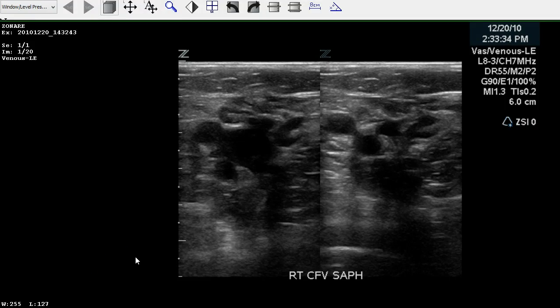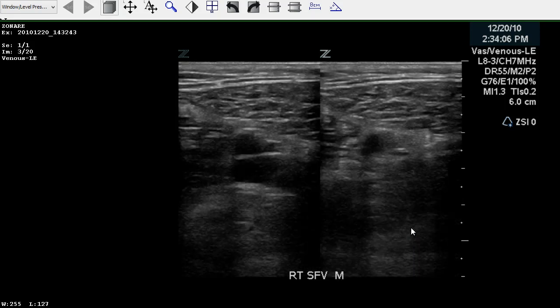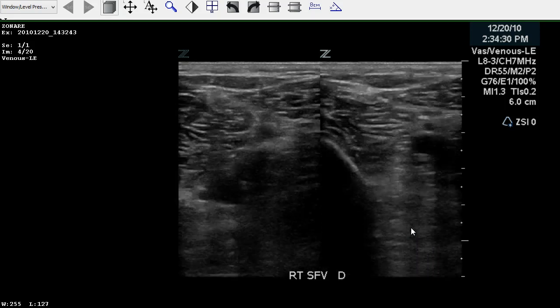Let's go through some key points to look for in this study. Starting here at the beginning, you can see the common femoral and saphenofemoral junction appear to fully compress. We move through the thigh, and the femoral vein is all fully compressed.